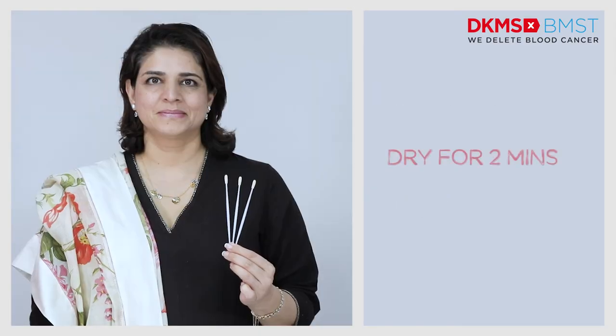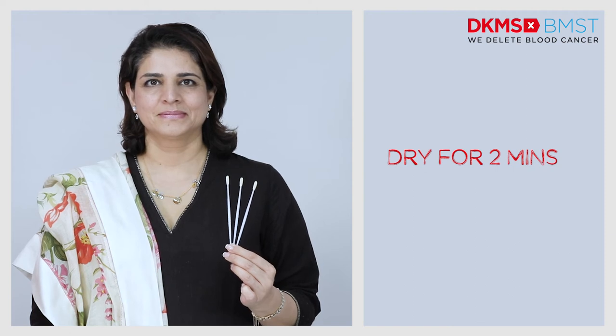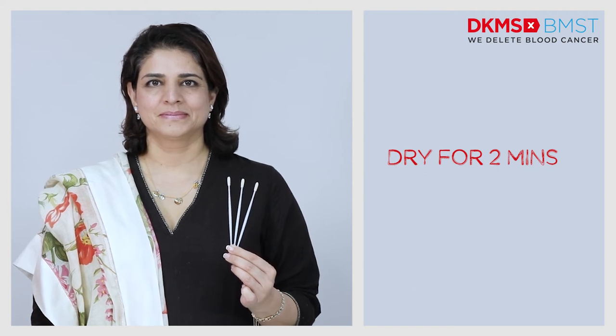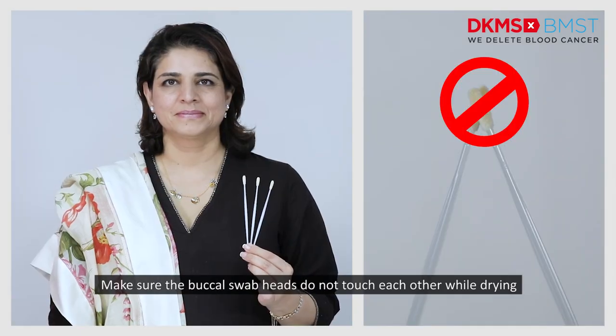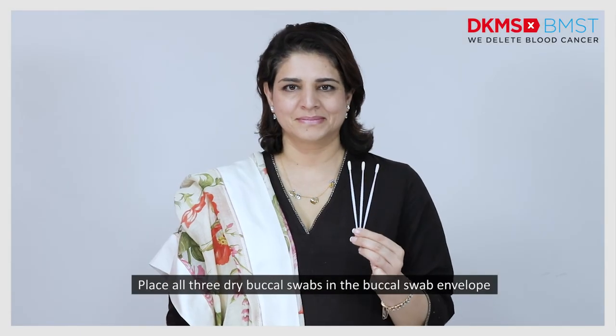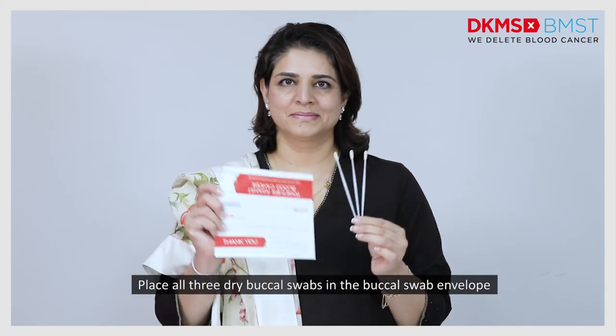Hold the buccal swabs for about two minutes until they are dry. Make sure the buccal swab heads do not touch each other. Place all three dry buccal swabs in the buccal swab envelope.